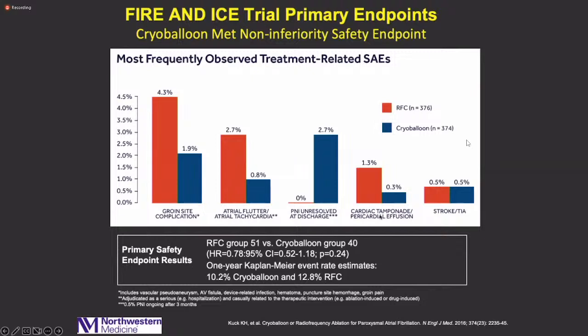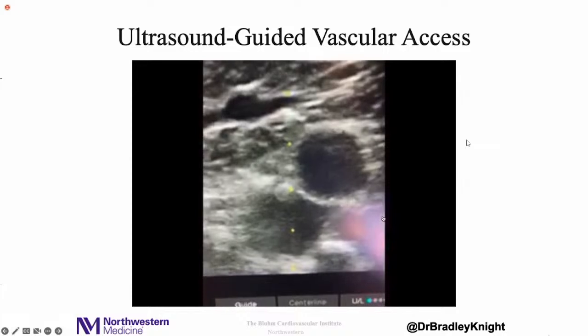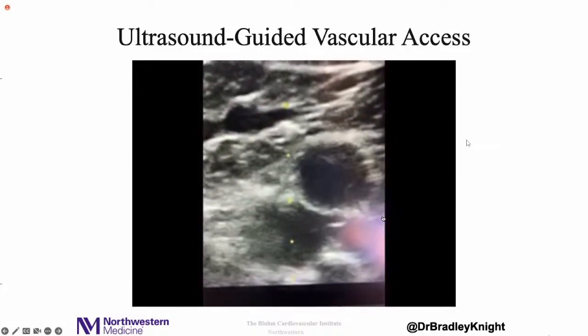Tamponade, I still think, is probably reproducibly higher with RF than with cryo, and the risk of stroke is quite low in both groups. Dr. Nair talked about vascular access yesterday.